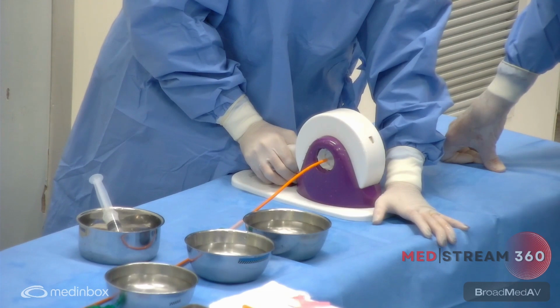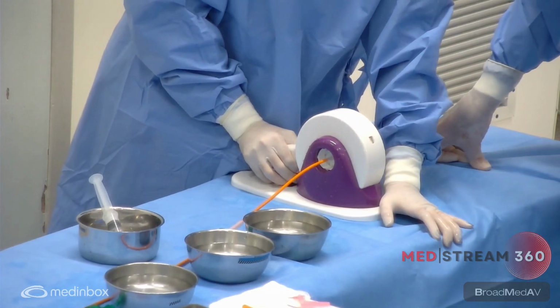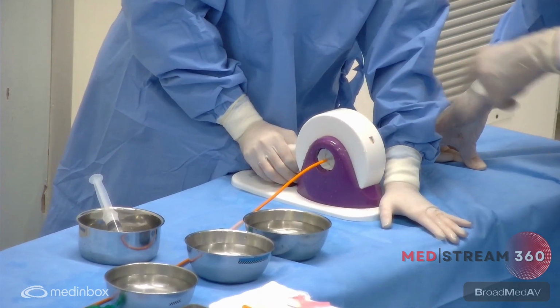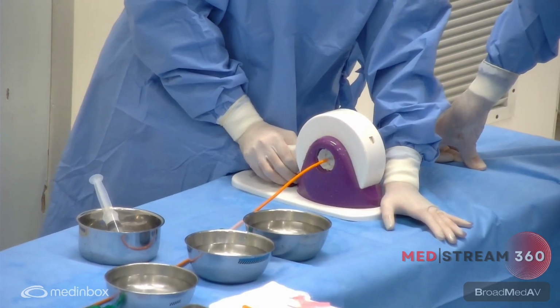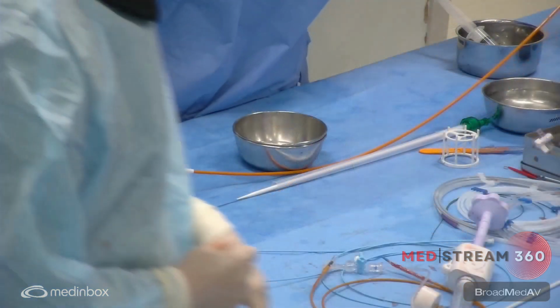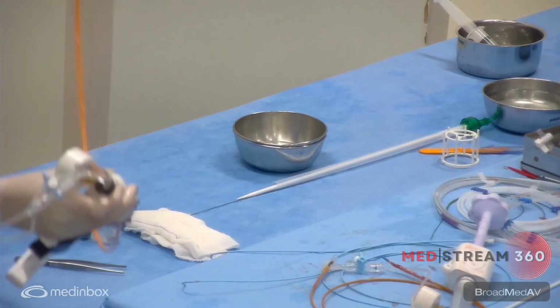So this is Corina, crimping, because we got a good sealing with the 20 balloon, right? Okay. How long are you doing this? 15 seconds, crimp the valve. So the valve is ready. Yes, the valve is ready now. Then Corina is bringing it.